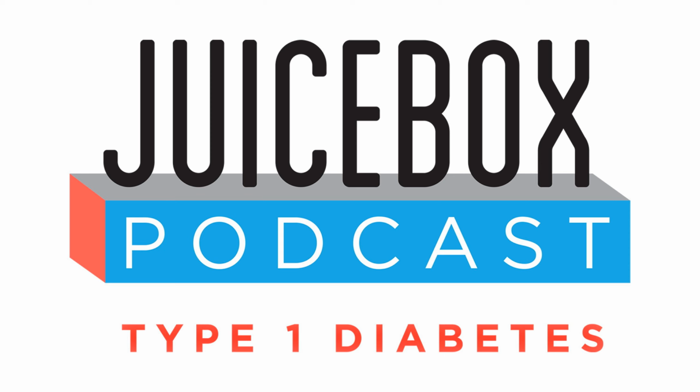And that's one reason even endocrinologists know that insulin lasts longer than 2 or 3 hours. They like to set people at a 3 hour, because for most of that curve, a 3 hour, 4 hour Walsh model will accurately represent how much insulin's on board, until of course you get to the end when you say, hey, it's over after 3 hours and there's still 2 more hours left. And so then people are like, oh, well, it says no more insulin's on board. Why does my blood sugar keep dropping? Well, it's because there really is more insulin on board, but your pump is lying to you. So you either have your pump lying to you the whole time until the very end when 0 is 0, and then you can kind of just round down, or you set it shorter and then it's accurate most of the time, and then at the end you still have insulin on board left for another hour or two.